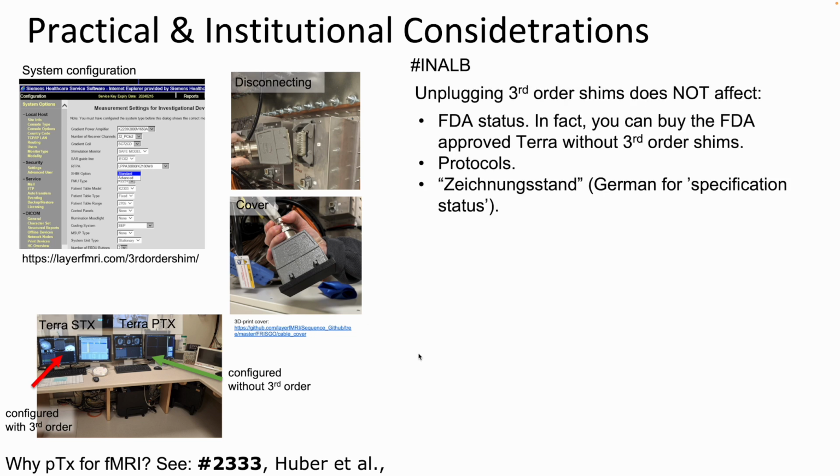While the science is pretty clear, suggesting that you should always unplug the third order shim, I found that some managing institute directors are sometimes hesitant, and there are some unfounded legal skepticism about unplugging the third order shim. As far as I can say, the FDA status is not affected by unplugging the third order shim. Certainly the protocols are not affected if you reconfigure the system like that. The Zeichnungsstand also doesn't change.